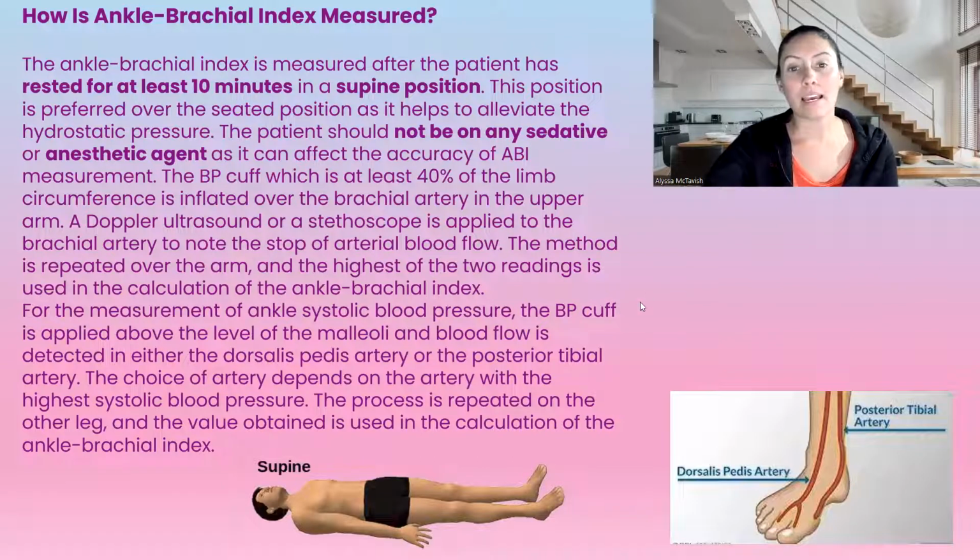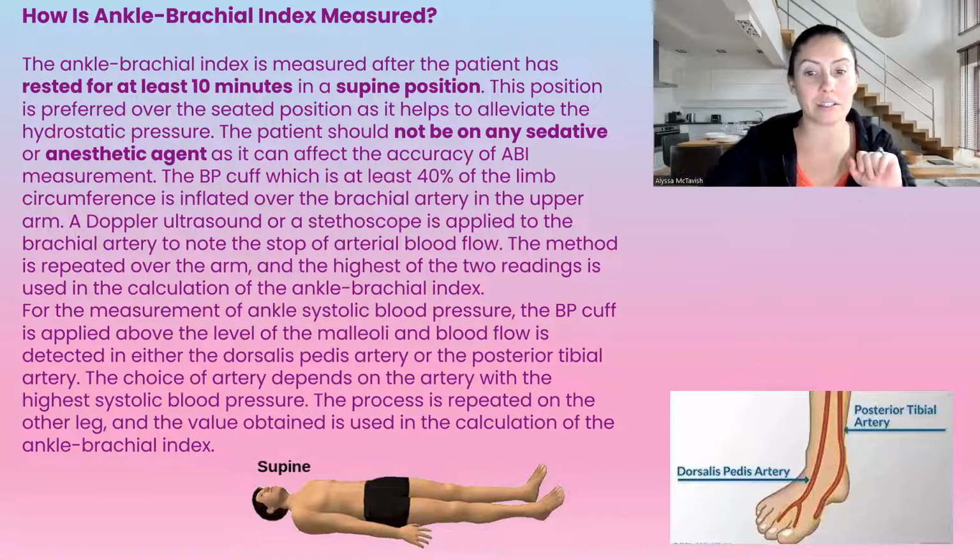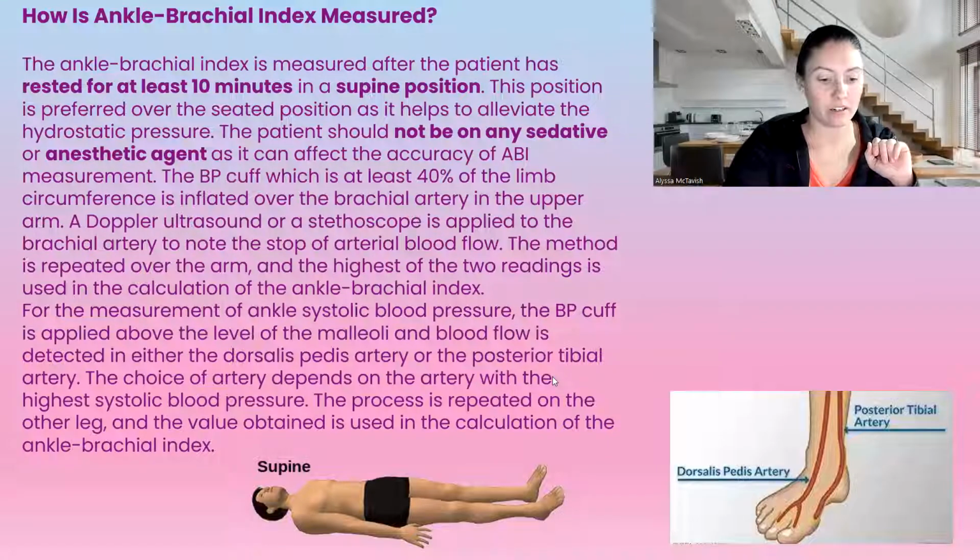And then you're going to make a calculation for each leg using the highest arm systolic number and the highest leg systolic number for each leg. So 2 calculations, okay? And I'll show you that in the next slide here.